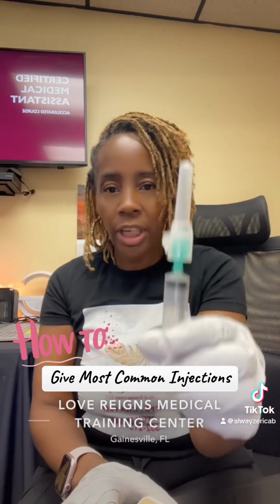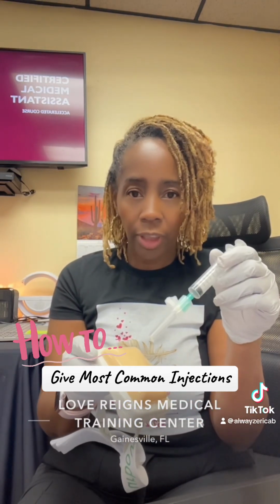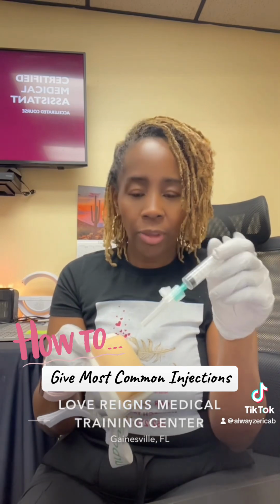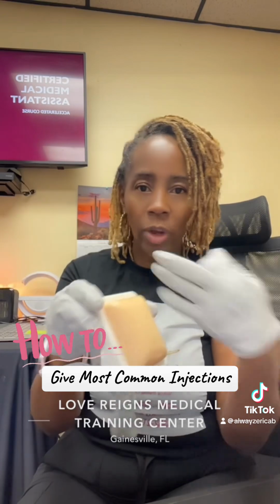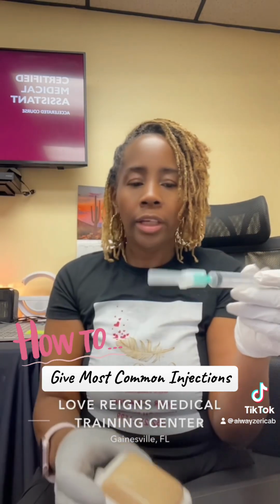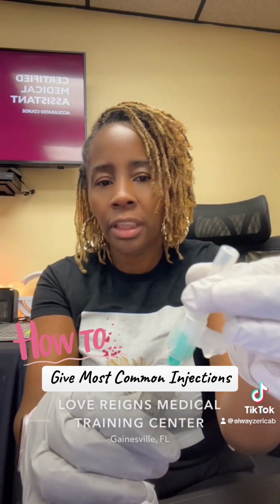This is an IM injection. This is a 90-degree angle. We would have cleaned that site the same way. Okay, and I just want you to know that I will clean from the insertion site away from the site. Let it air dry. We're not waving it dry. Let it air dry. And then this is what's called a needle activation device. So basically we'll pull that off.